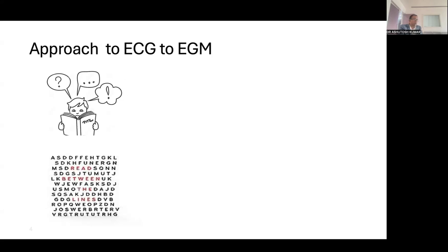If you come into the cath lab, or the EP lab, you will see a lot of monitors. Usually in the cath lab, two monitors are there on which we see only the cine images and the fixed images, on which we identify the block and put a stent. But in the EP lab, we have at least three monitors. One runs the ECG, one has the fixed ECG, meaning captured information, and two more monitors show the cath lab fluoroscopy images. These are the four in the conventional EP study.